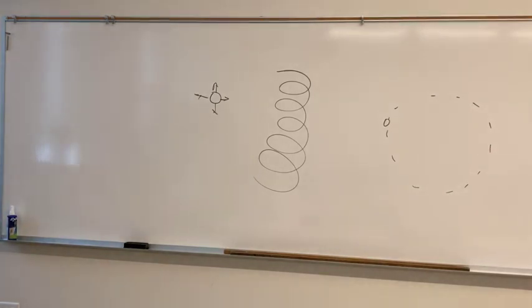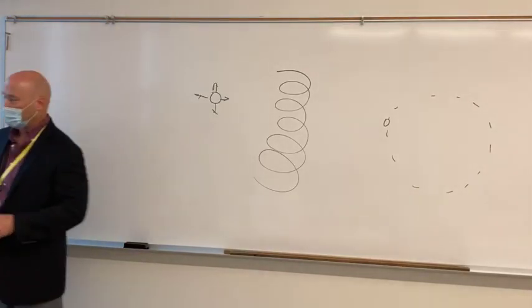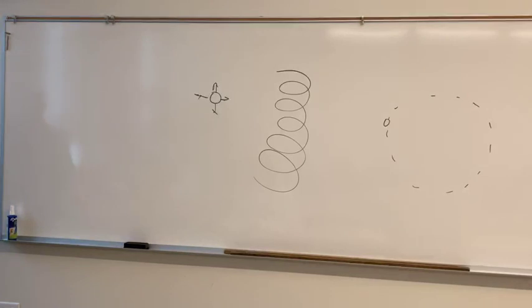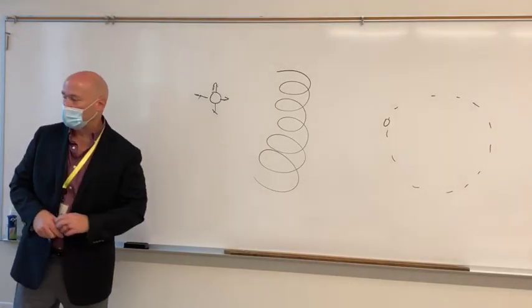So what we're going to do today, and I talked about electromechanical devices, really anything that you put into the circuit that uses the electricity or manipulates it in any way is an electromechanical device. Specifically in the circuit, what I talked about was the turning of the rotor. So electromechanical devices either create electricity with mechanical energy, or they create mechanical energy with electricity.